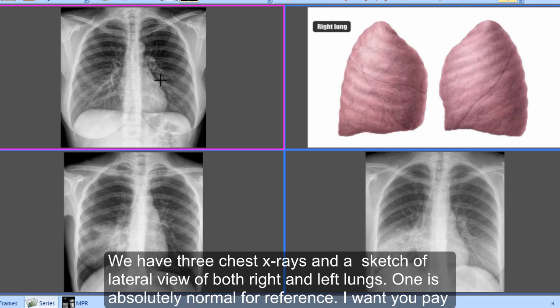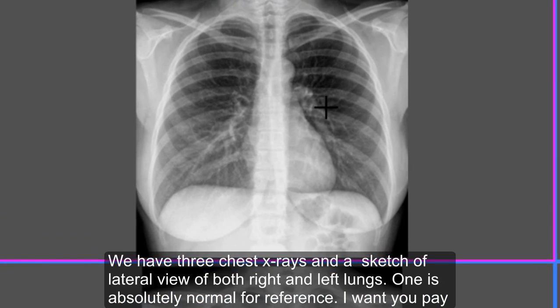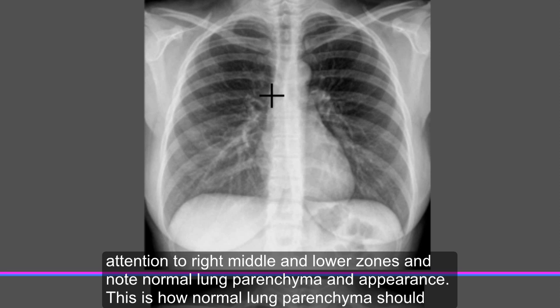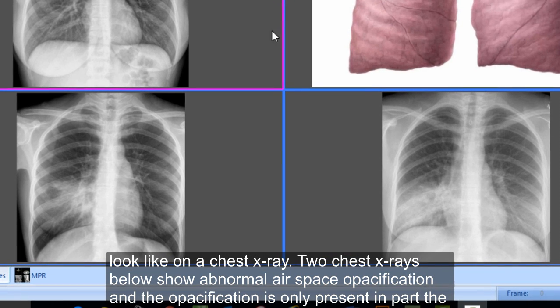We have three chest X-rays and a sketch of a lateral view of both right and left lungs. One is absolutely normal for reference. I want you to pay attention to the right middle and lower zones and note normal lung parenchyma in appearance. This is how normal lung parenchyma should look on a chest X-ray.